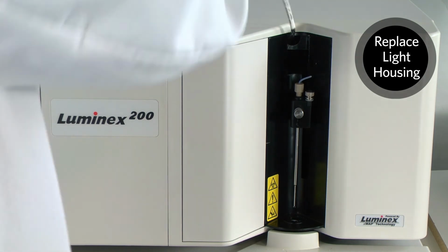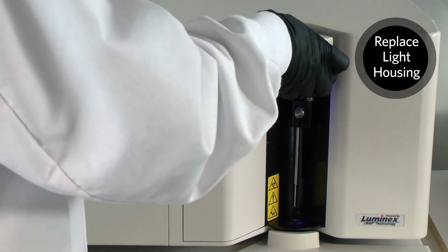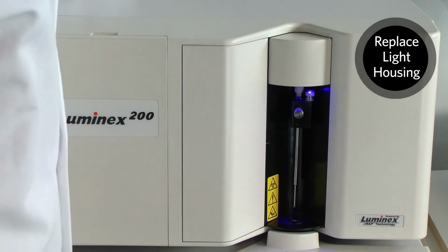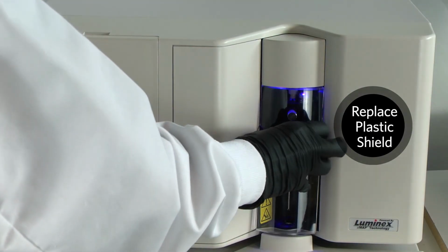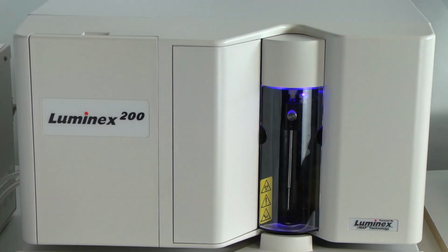Replace the light housing and ensure that the sample line does not get pinched or caught by the plastic edge. Finally, replace the plastic shield. The sample probe bypass test is complete.